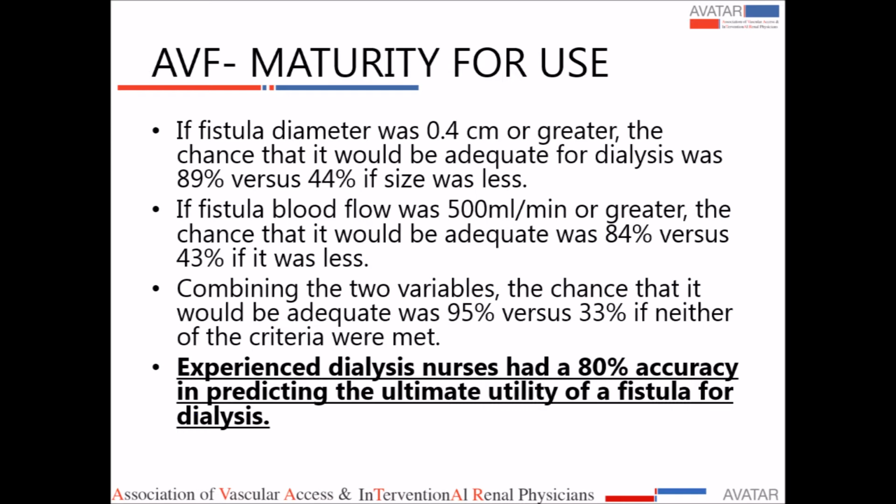But one interesting point in this article that sometimes we all miss is the fact that experienced dialysis nurses, so if you get your best nurse to look at the access and she says that they can use it, they can probably use it. And this was actually pretty accurate.